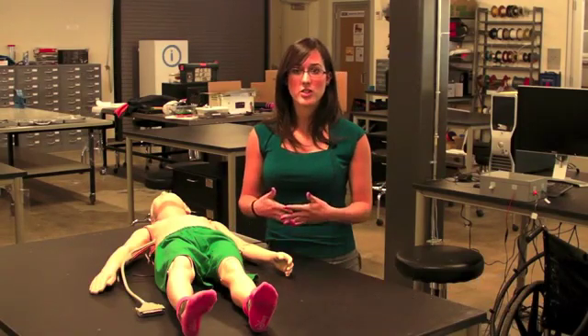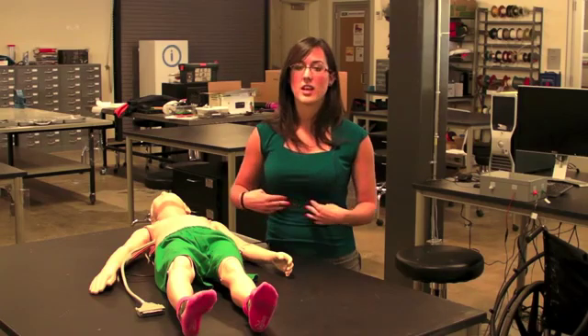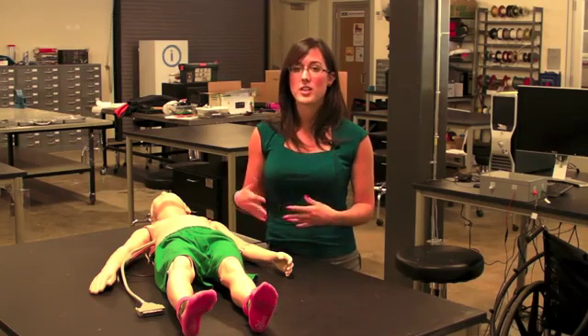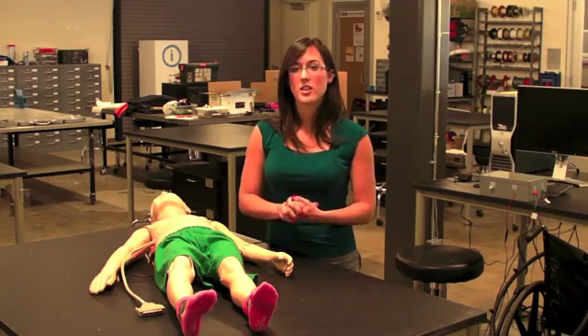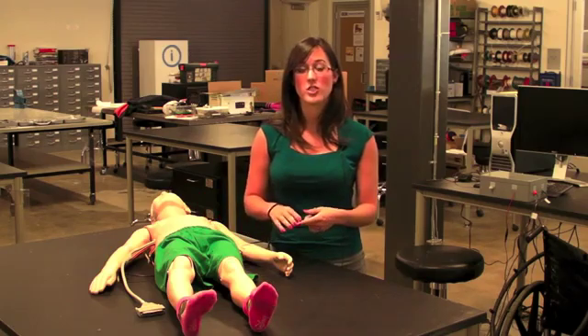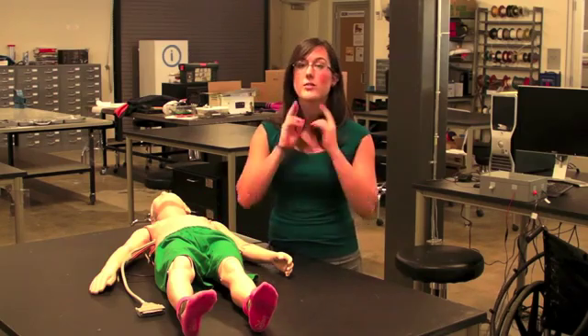This is a mannequin for the physical exam. It teaches the skill of palpation, which is when the doctor uses his hands to feel the size, shape, location, and feel of different objects in the body. This mannequin simulates an enlarged liver, spleen, and lymph nodes in the neck.